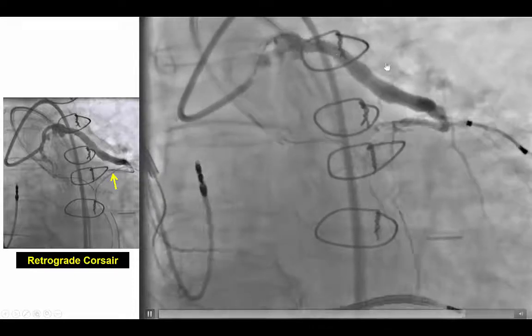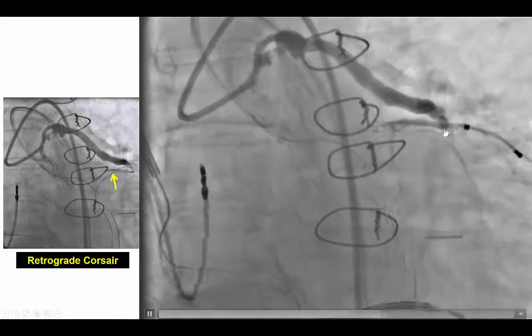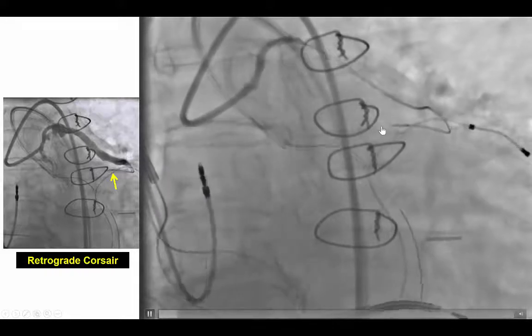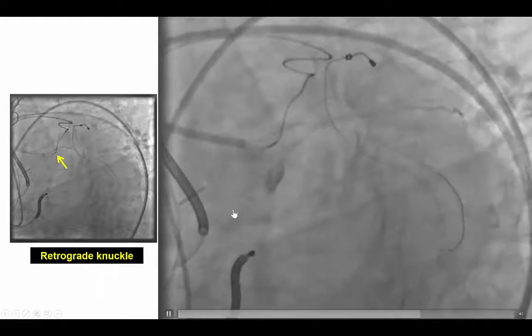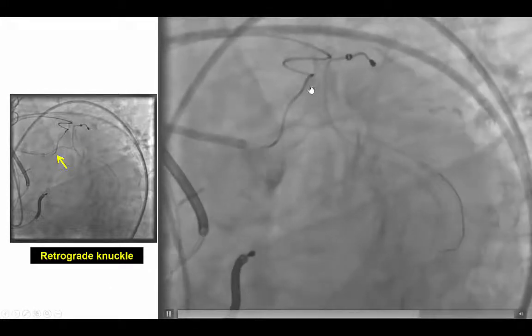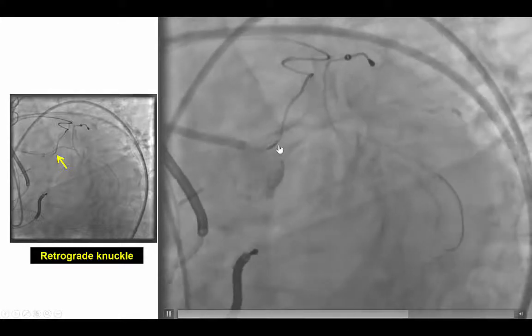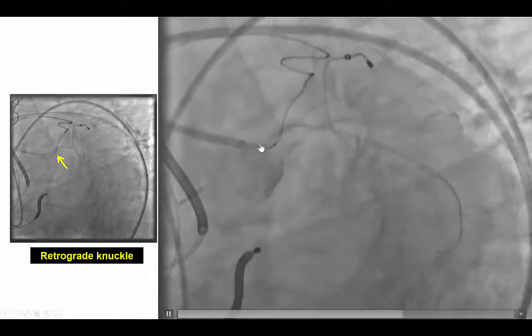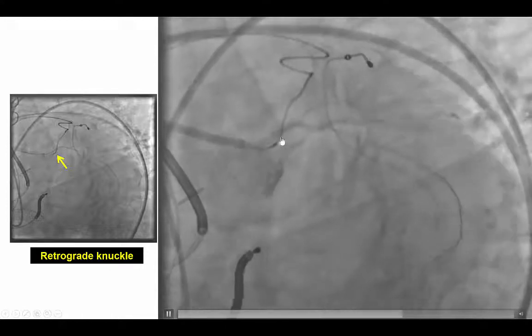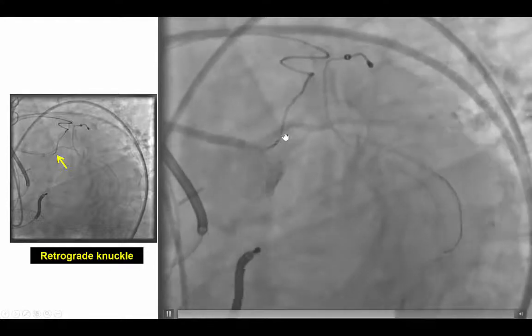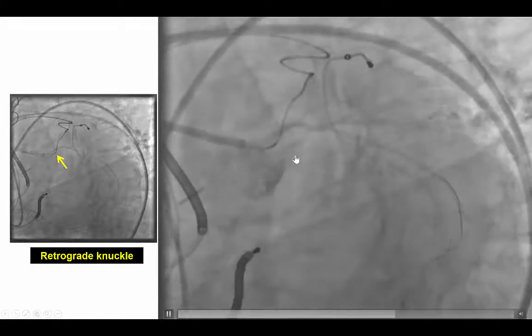We were able to advance a Corsair microcatheter through the vein graft into the LAD and retrograde into the distal cap. After doing that, we were able to advance a guidewire further, but unfortunately the wire went into the sub-intimal space. We did have a safety wire into the circumflex, which is very critical because attempts to wire through the left main can cause dissection and potential occlusion of the circumflex coronary artery.